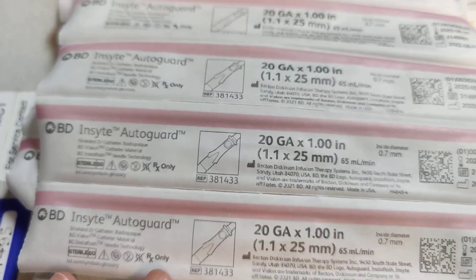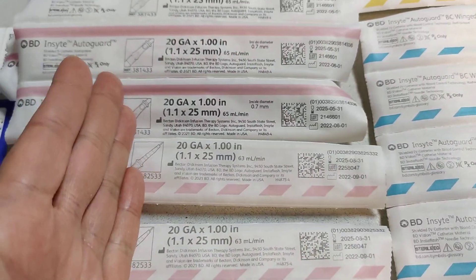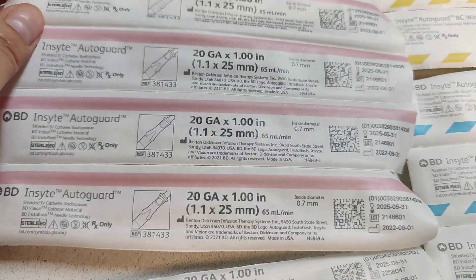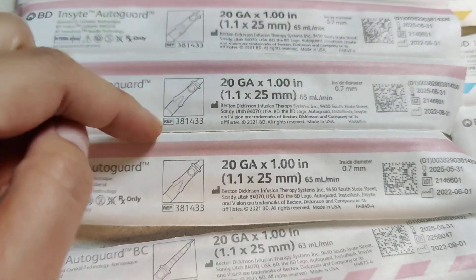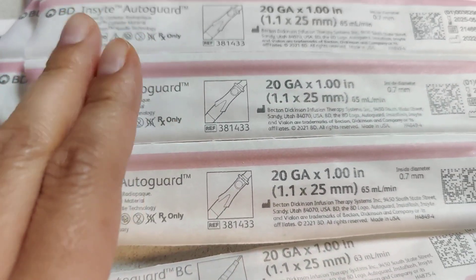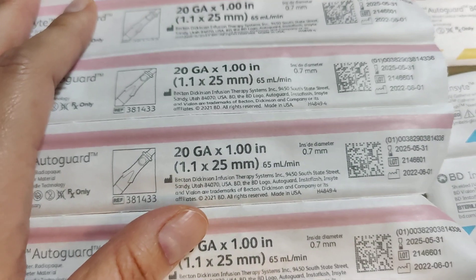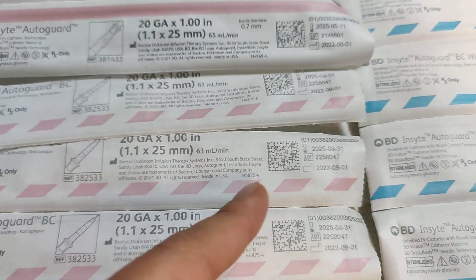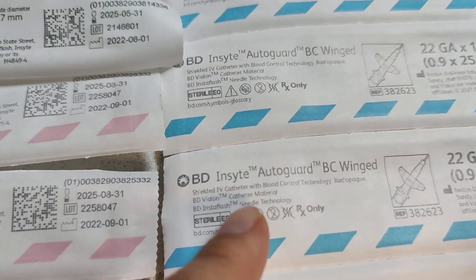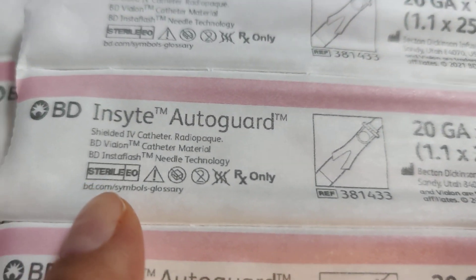I've gotten mixed up a few times because I'll just grab by color — pink is 20 gauge — and I've had a few times where I had a little mess because I used the one that's not blood control and it'll just literally squirt out. I got so used to using the blood control ones that I forgot about the others. You can tell the difference by the lines: the dotted lines are blood control, and the solid lines are not blood control.